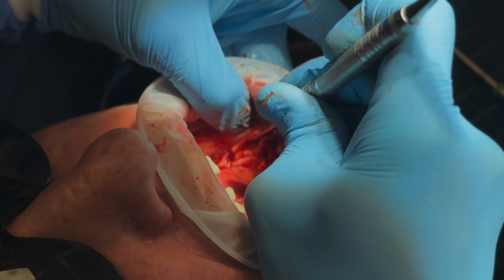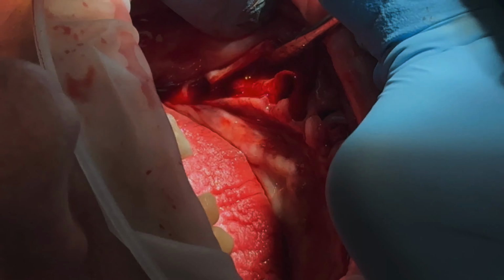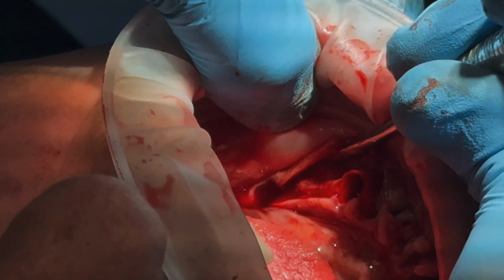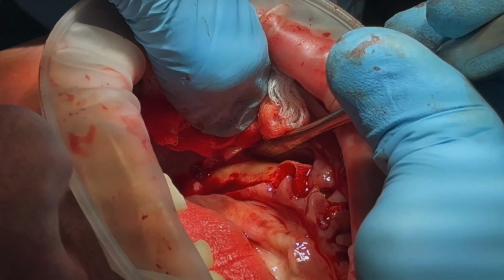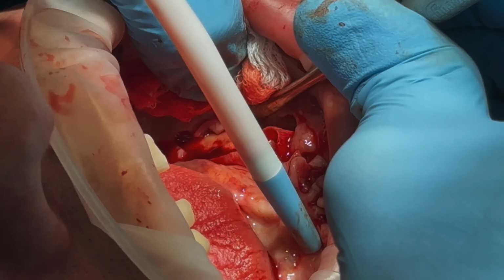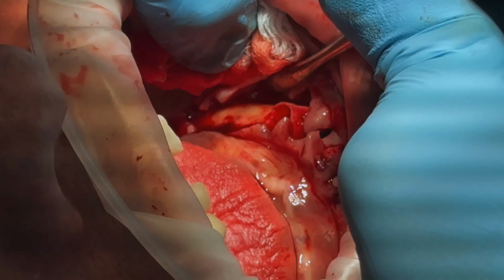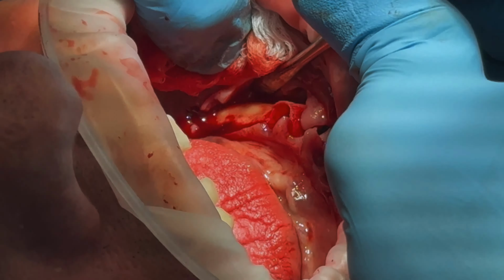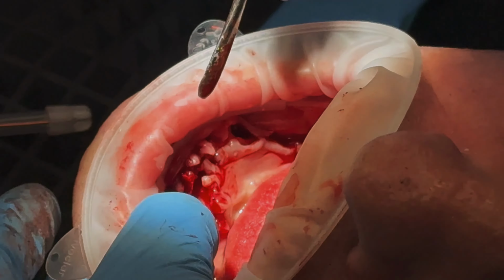So we elevate the gum off the bone. What I'm doing is I'm just lifting the gum, trying to look for the mental foramen. So just about see where my elevator is, where the exit of the nerve is. And then just about there. You just see the concave exit. So that's our boundary. You just have to avoid it.